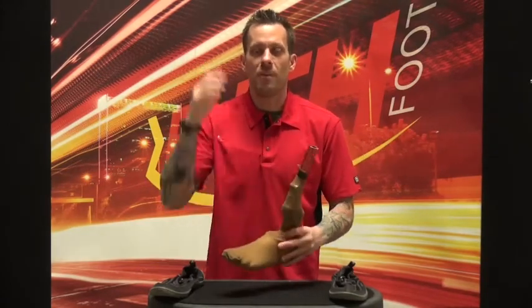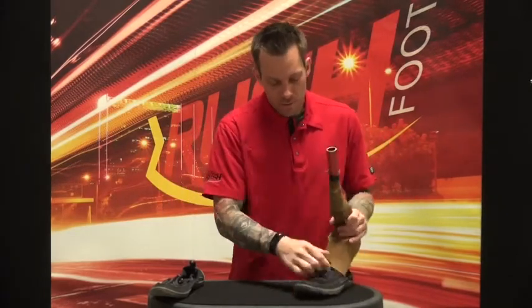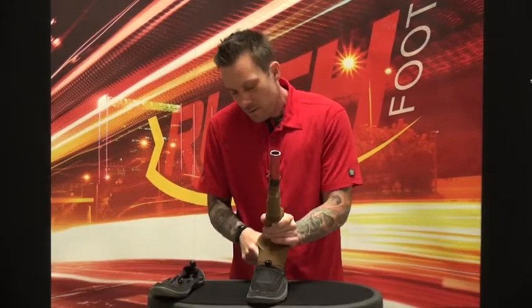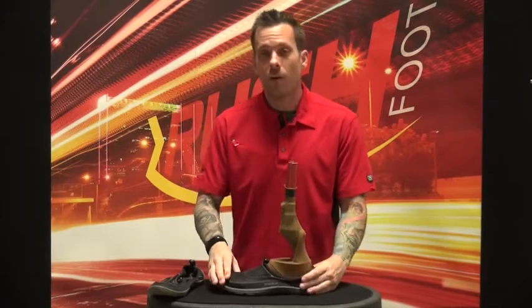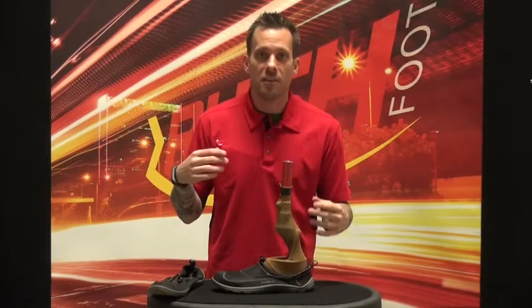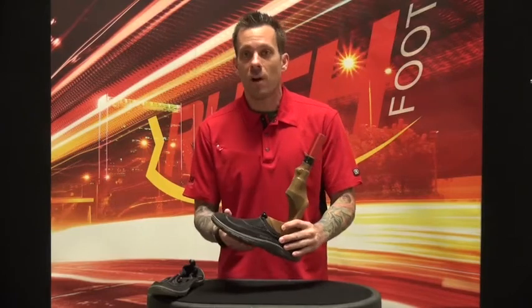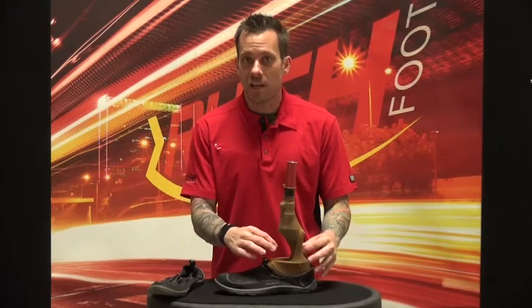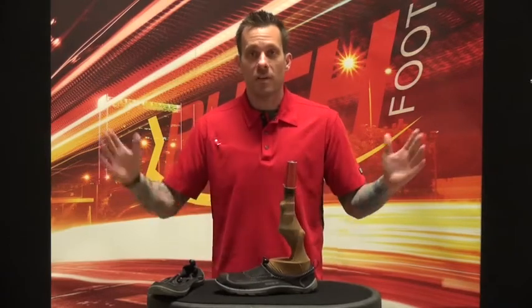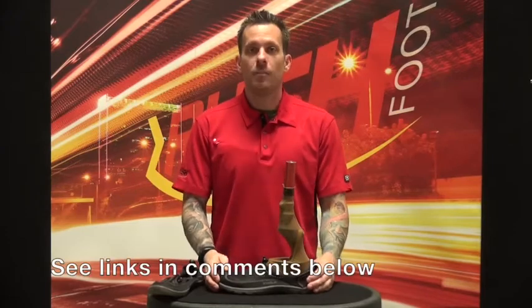Keep in mind, another reason why I like the water shoes is because even after I've put my pantyhose on my foot, you're going to walk around on sand and rocks and might burn a hole right through it and defeat the purpose. So now that I've put my pantyhose on, I can put on my water shoe, and now I'm ready for a day at the pool or beach. I don't have to worry about breaking down my foot shell or wearing it out prematurely, and I don't have to worry about rocks or debris getting inside.